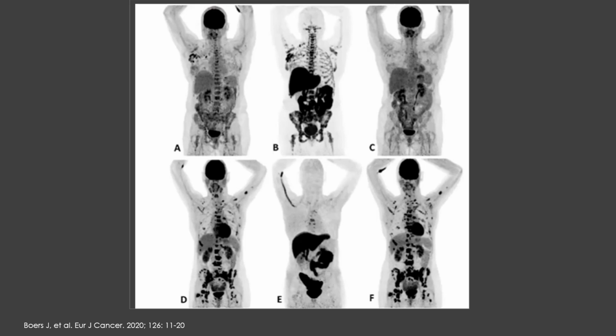And then after 8 weeks of therapy, the FDG was repeated, and you can see that there is absolutely no metabolic response, even some increase in the pathologic uptake in multiple skeletal lesions, which indicates that the patient is getting worse with the hormone therapy. So bottom row again is FDG, FES, and FDG in the patient who is HR negative and did not respond to treatment.